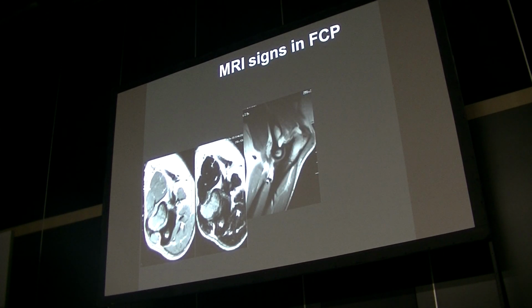So this is a case where we were looking on MR. This is a transverse T1 image where we administered IV gadolinium, and the sagittal T2 image. We are able to pick up a very discrete change in signal in this area where the medial coronoid process is. Here you see it as well, a quite subtle lesion.